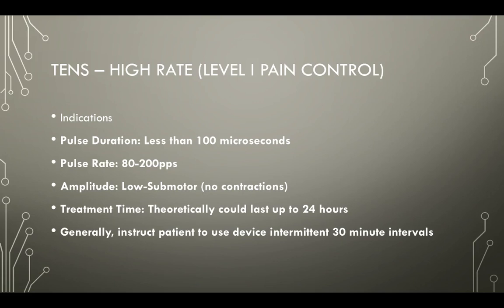So again, if the stimulation is perceived over a really large area, so it's not really targeting the tissue you specifically want, you can potentially increase the pulse duration, and that will help shrink the area. If the stimulation is perceived as stronger than we really need, we can also try to decrease the pulse duration, and that might affect things. We can also adjust the electrodes, because again, maybe we're over one of those stimulation points, or we want to be over one of those stimulation points if we're not being able to get the results we want. So that's something that you can adjust as well.